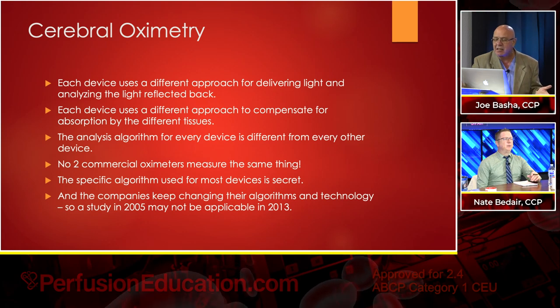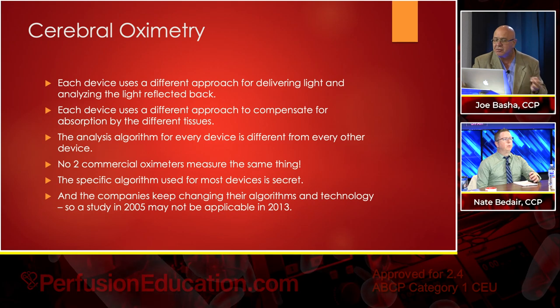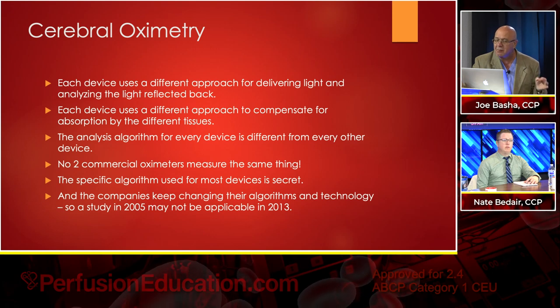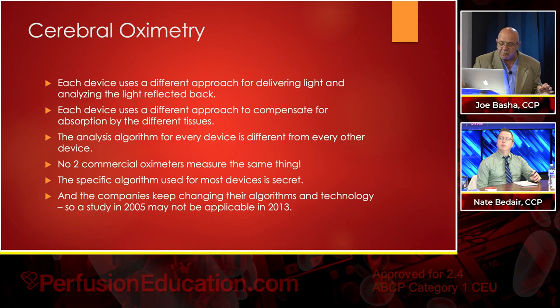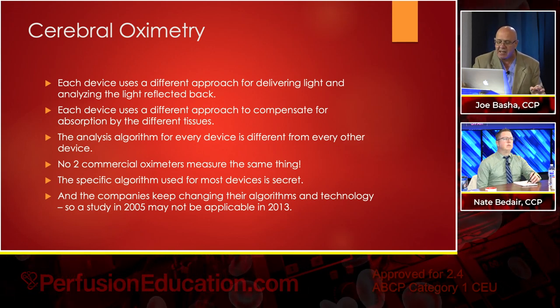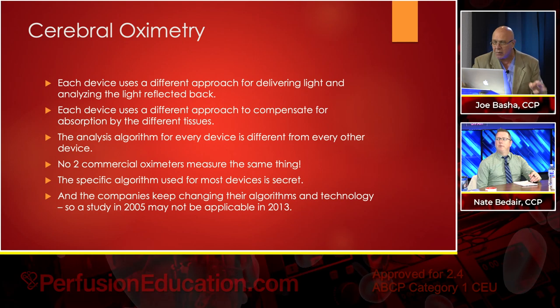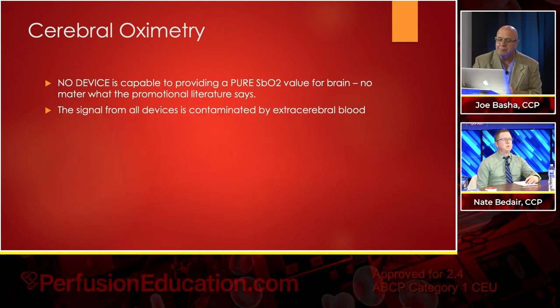The analysis algorithm for every device is different from every other device, and no two commercial oximeters measure the same thing. The specific algorithm used for most devices is also a secret, and the companies keep changing their algorithms and technology, so a study done in 2005 may not be applicable in 2013 and thus 2020. I think we need to take that seriously into consideration.